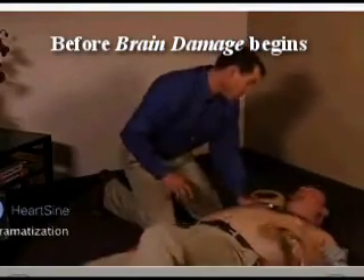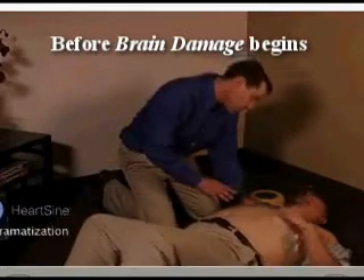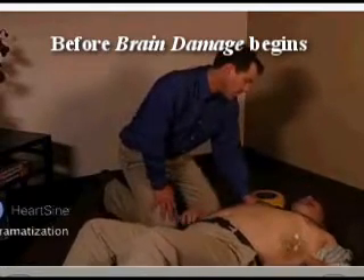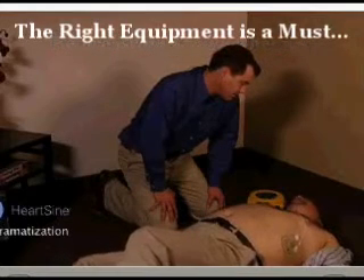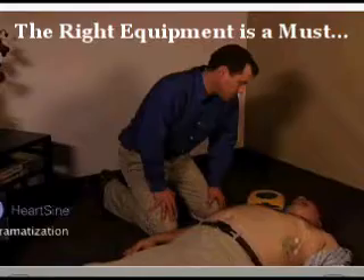It is safe to touch the patient. Begin CPR. Jim, can you hear me? Relax. Help is on the way. The combination of CPR and defibrillation is the best rescue technique you can practice until medical professionals arrive on the scene.